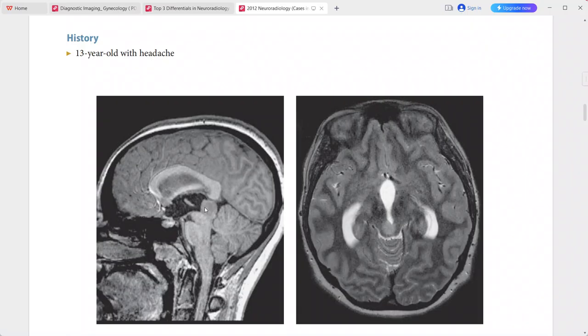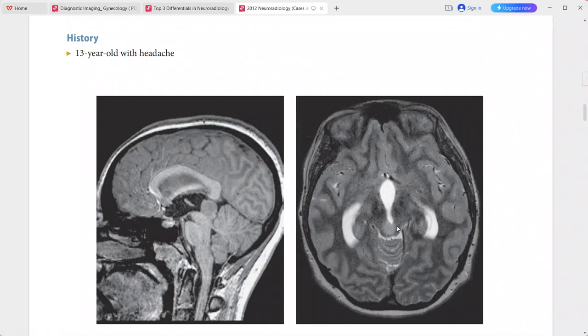There is obstructive hydrocephalus with enlargement of the third and lateral ventricles due to stenosis of the cerebral aqueduct caused by this lesion. This is a case of tectal glioma.